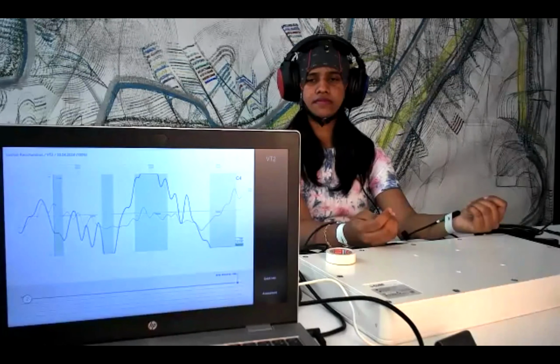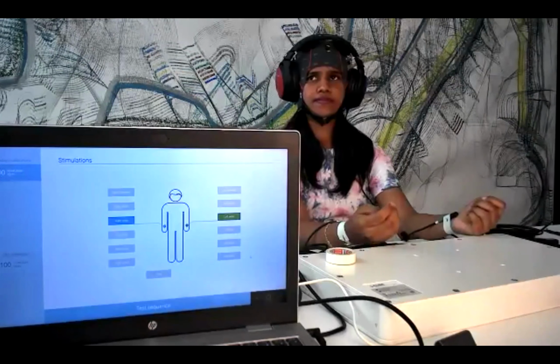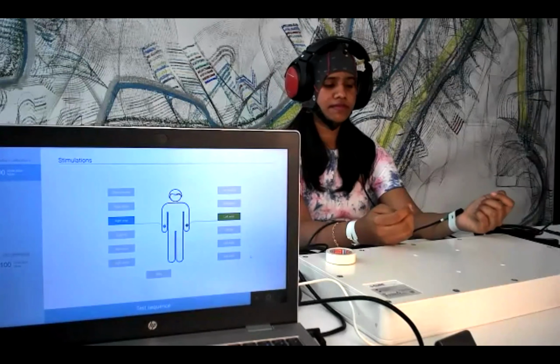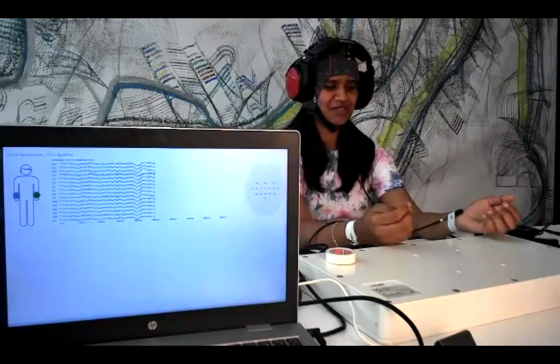So take a look again. And then we can continue with a quick test. So for the quick test, as I explained before, basically the setup is exactly the same. So the task for Vaishali is still again to count the left wrist. That's a target stimuli and ignore the others. But of course, this time it will be shorter. So she really needs to be fully concentrated so that we can get, again, the perfect accuracy.